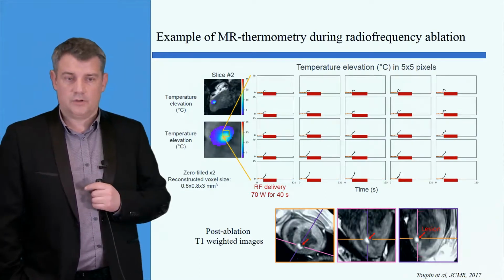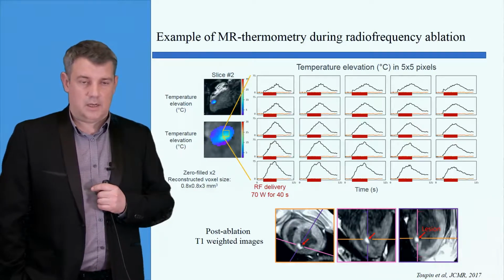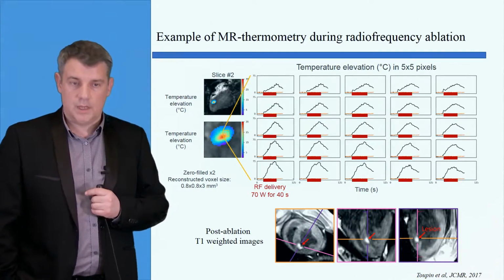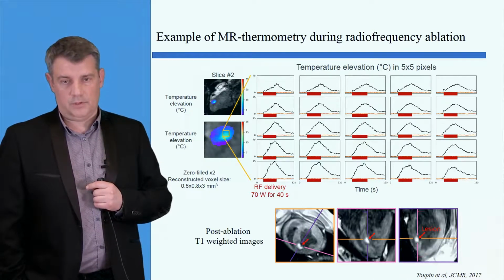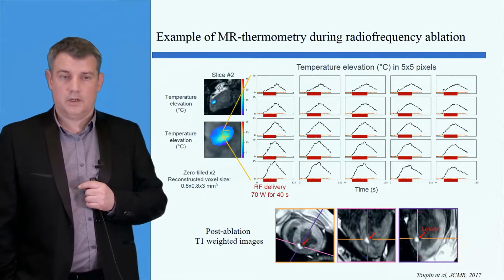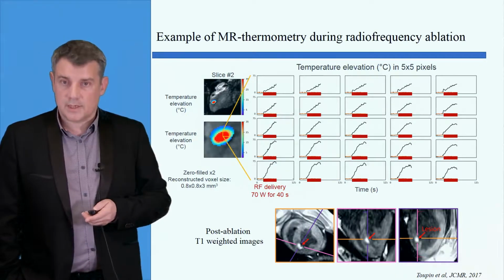And we have shown, you can read the paper that is cited in this slide, that we have an excellent correspondence between the thermal dose and the 3D post-ablation T1 weighted images. In other words, you can rely on the thermal dose images to predict the lesion size.